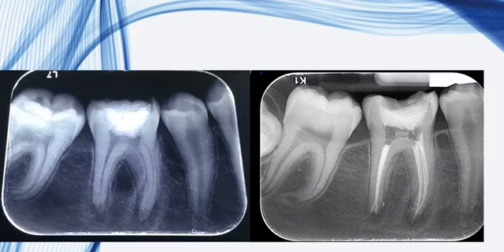Sometimes with reciprocating, you have more feeling of what you're doing. You have more control of your file. It's just a personal opinion. So you can see that the file cuts more and you have control of the file.